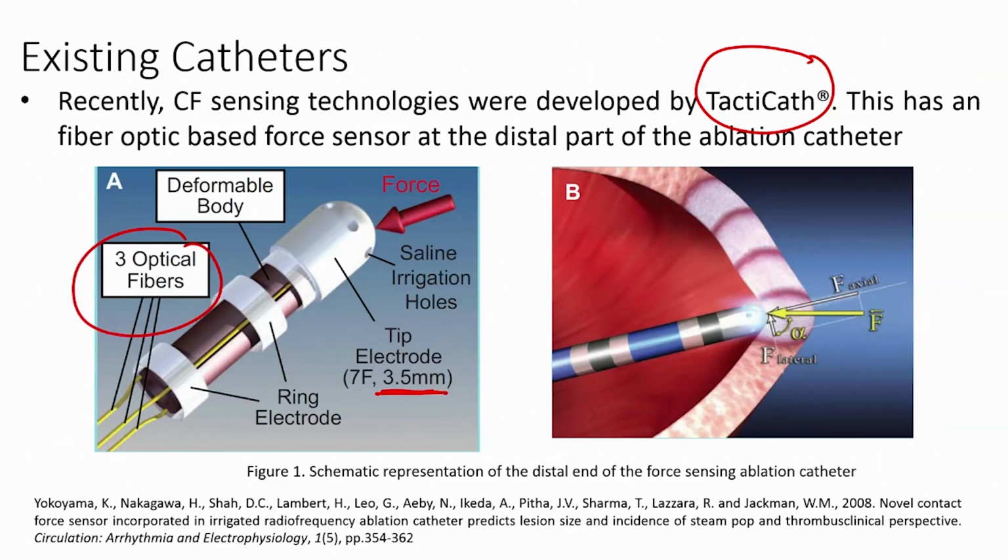So, if the body deforms, then correspondingly, using optical fibers, the force is measured. You can see here normal force, axial force, lateral force.